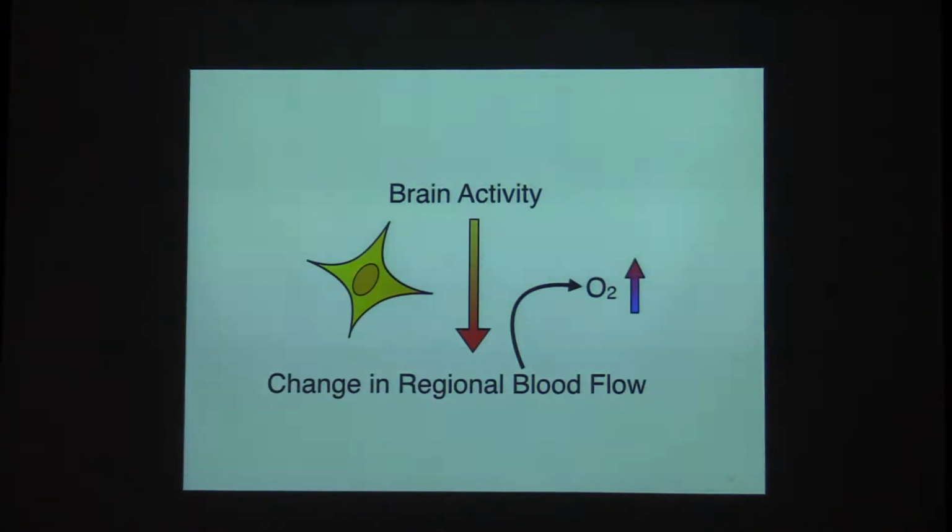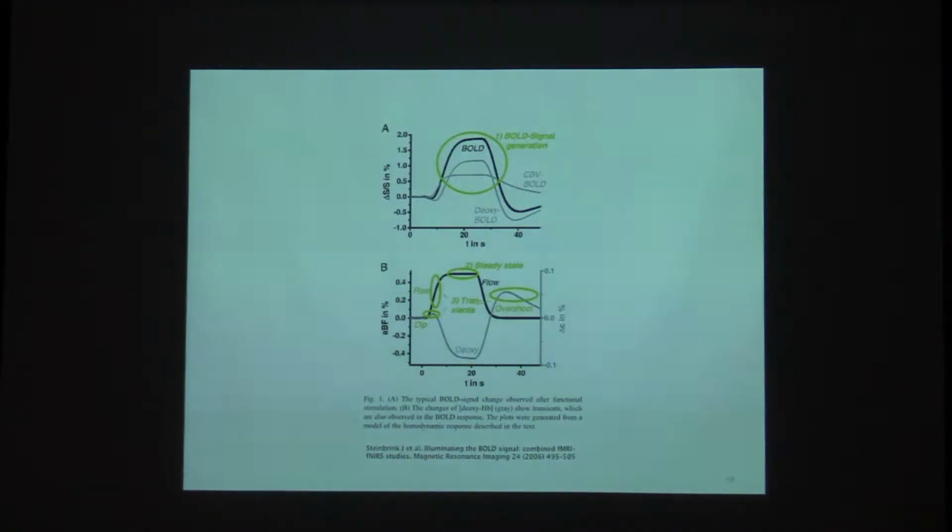And you can actually model this and say, okay, you're looking at your nerve activity and then the change in the blood flow that occurs. And it's not immediate. It doesn't happen in microseconds. It happens after several seconds. And that is the top image over here.